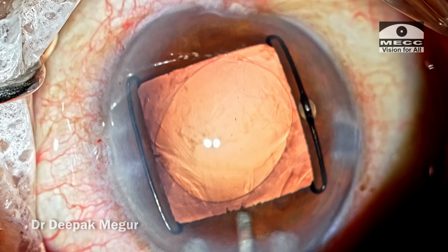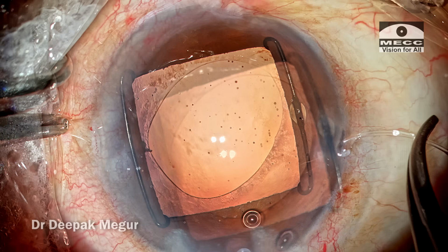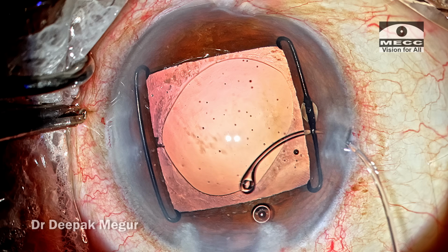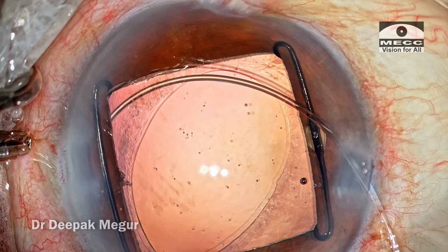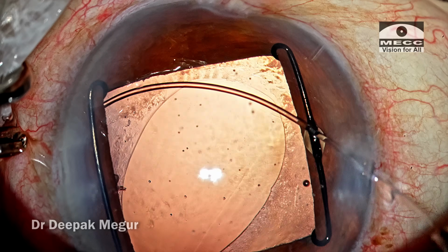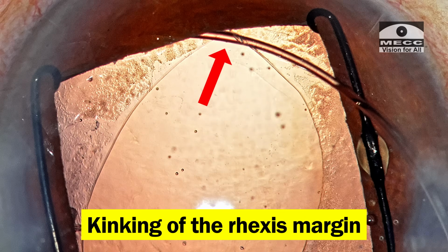And now is the time to implant the lens. Before implanting, I would like to push the CTR into the bag because, looking at the health of the zonules, I would definitely prefer to use the IOL trap technique rather than placing both the lens and the CTR in the bag. The CTR goes into the bag, and one trick to know that the CTR has gone in the bag is to look at this kink which is seen here on the rhexis margin.